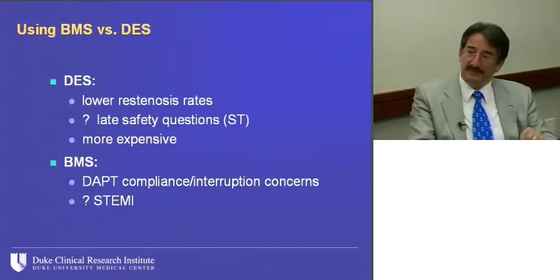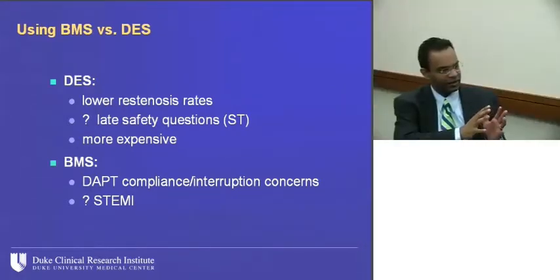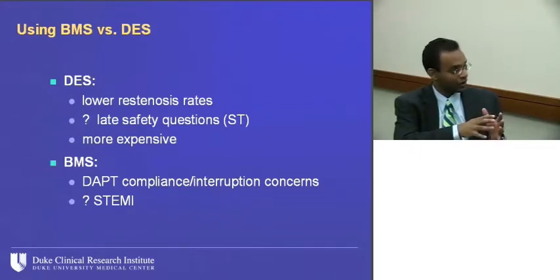Mitch, let me ask you a quick question. We have lamented in the academic world the lack of active controlled trials for a long time. And yet, as you pointed out, in the drug-eluting stent world we now have a wealth of trials that have done that. Is this something that was driven by the drug-eluting stent market? Is it something that was mandated by the FDA? Or is it simply that the bar has gone higher for new drug-eluting stent platforms to get approved?